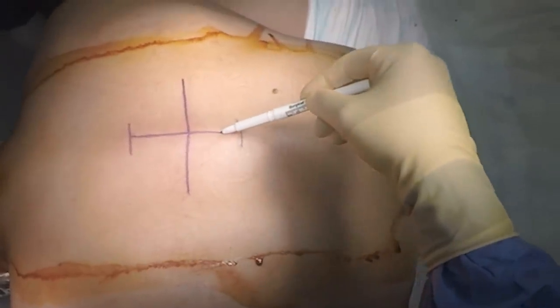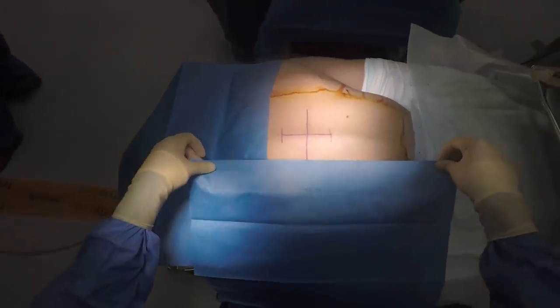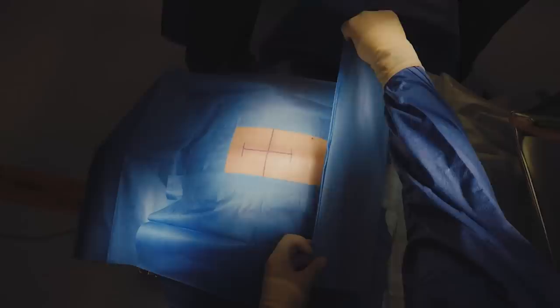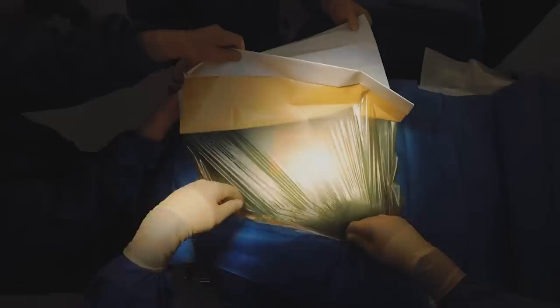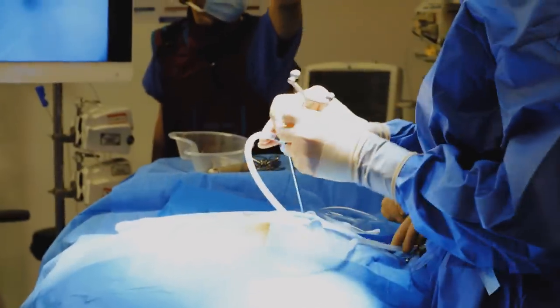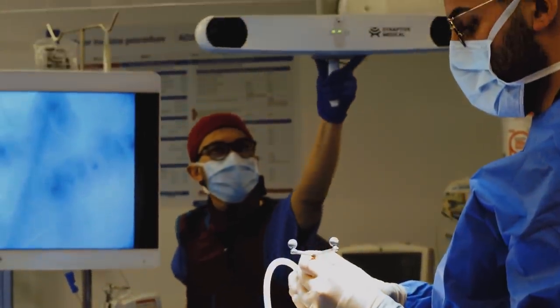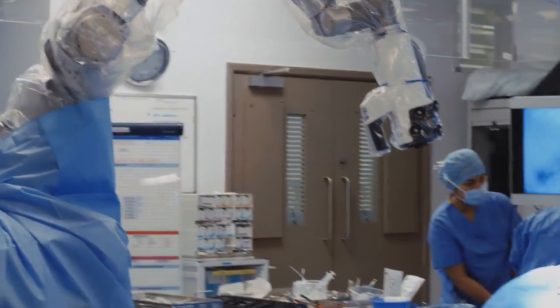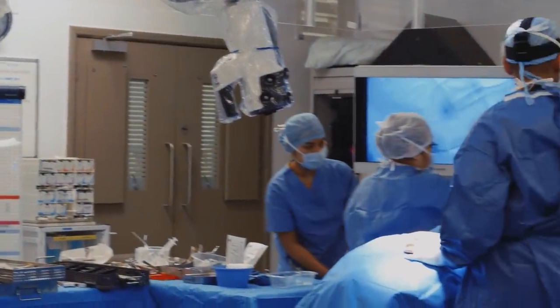We start by marking the back where we think the bullet's going to be and then we prep and drape with these blue sterile drapes. Next we put something called IBAN on which has got antibiotic - an antiseptic film which protects the patient and us. We get all of our instruments ready before we make the first cut and here you can see the exoscope moving wheeled into position.